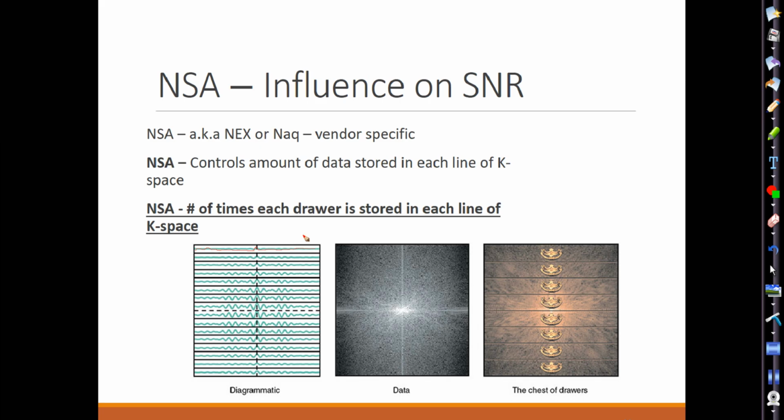And we know noise is random. We can't really compensate for the noise on your MR image. But increasing our NEX to 2 actually starts to average out the signal. So we increase our signal, and we're starting to average out our noise. This is good sometimes for those patients that aren't making drastic movements, but they're making slight movements in the scanner. Sometimes by increasing our NEX, we'll average out the noise or the motion of our image.